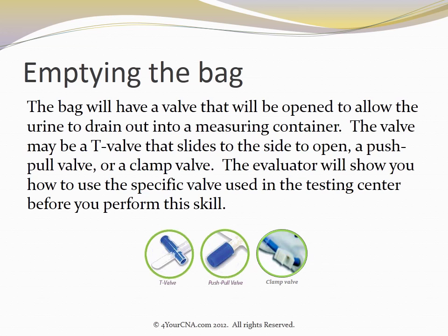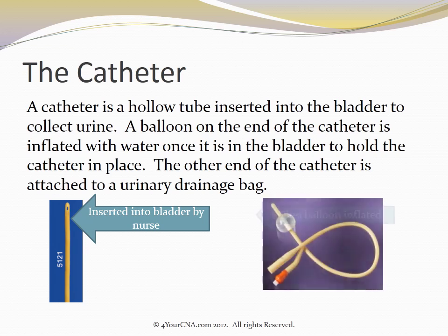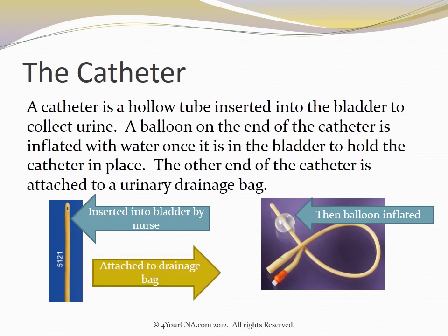A catheter is a hollow tube inserted into the bladder to collect urine. A balloon on the end of the catheter is inflated with water once it's in the bladder to hold the catheter in place. The other end of the catheter is attached to the urinary drainage bag.